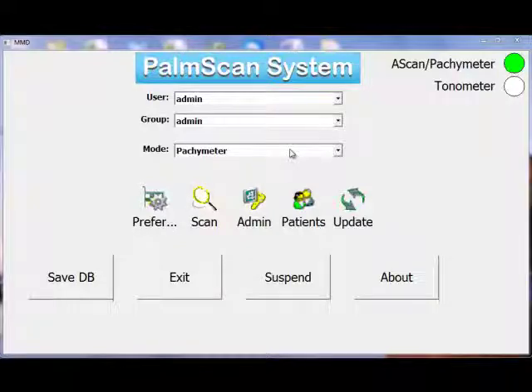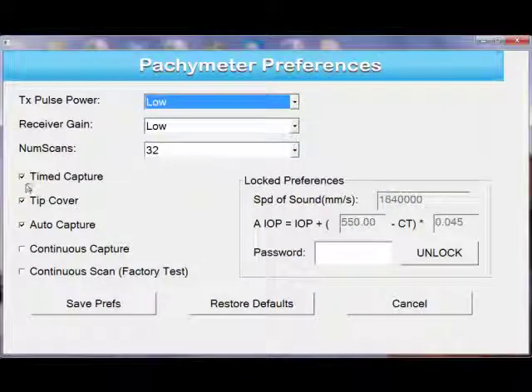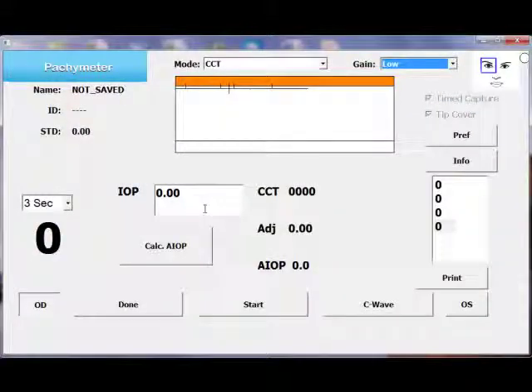Make sure that you put the mode of the device on the pachymeter. At this point, go under the preferences and select time capture and the cover on, as I have selected here, and save preferences. You only have to do that once unless you want to change the setting again. Now we're in the capture page in the central corneal thickness mode, and the gain I'm going to put on medium. The eye is selected — right eye versus left eye — at this location.